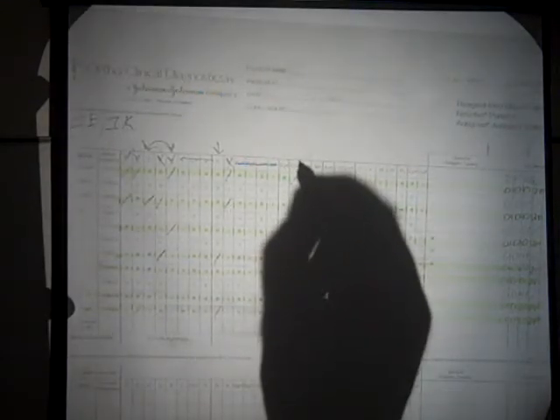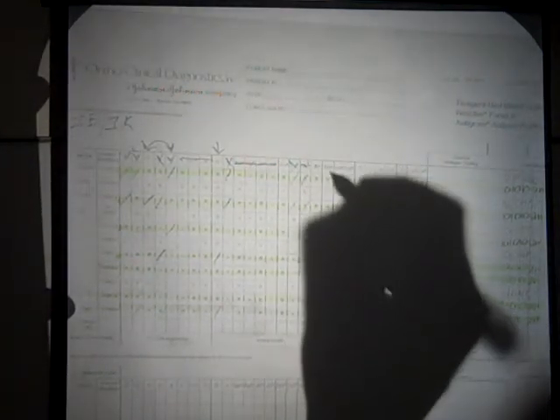There are no positive Duffy A antigens on negative reacting cell lines, so I can't do anything with Duffy A right now. Duffy B, looks like I can use cell 1 and cell 3, and I've effectively ruled out Duffy B. JKA, I can use cell line number 1 and cell line number 3, are my homozygous rule outs.